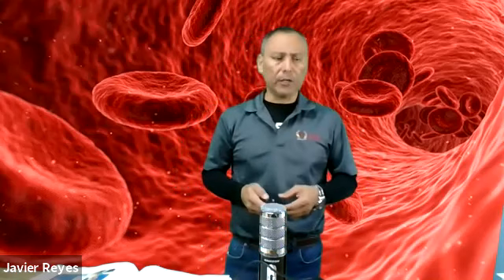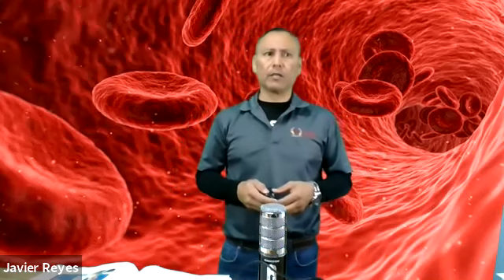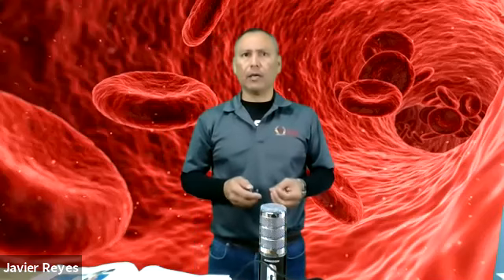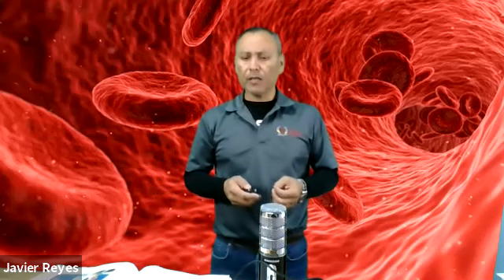Capillary punctures are performed on a routine basis, more so in other specific areas of the hospitals, especially in the newborn areas and the pediatric areas. But of course, they're also performed in the adult sections as well. So we're going to continue the conversation. We're going to start off by discussing some of the equipment that is needed or utilized in this area.